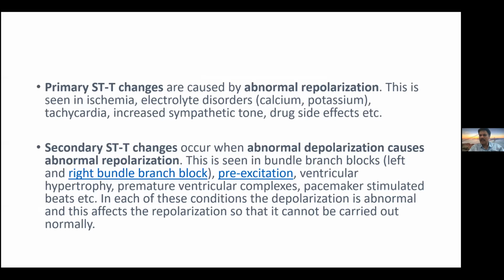Secondary changes are related to abnormal depolarization. This means there is an abnormality in the QRS complex, and this abnormal QRS complex causes abnormal repolarization.